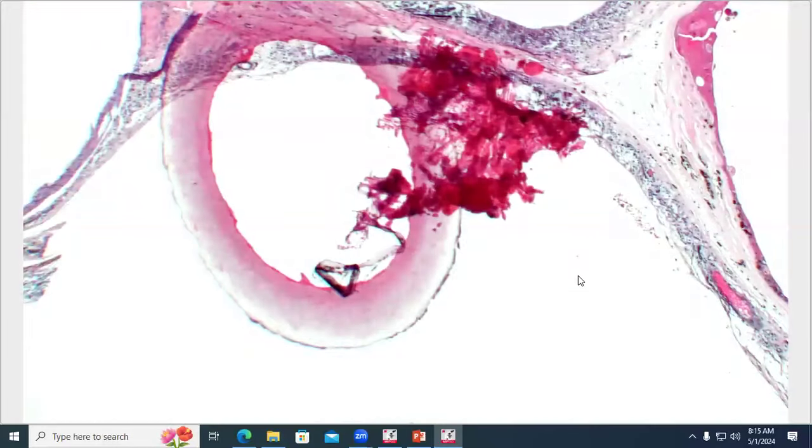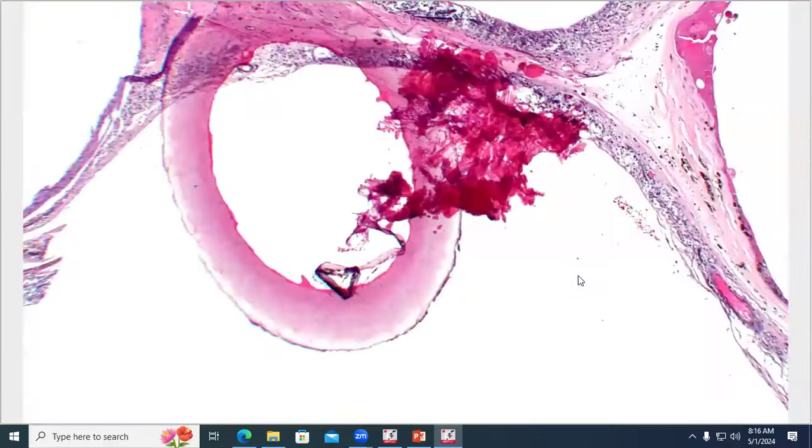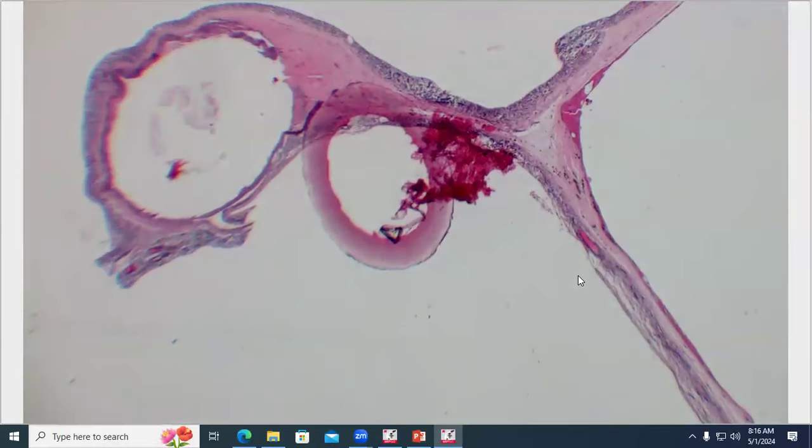So that's our foreign body. So it's a stiff, linear structure. Pull that out on top. Aha. Yes. Thank you for reminding me. It's a stiff linear structure that kind of is reminiscent of a hair. So perhaps a modified hair. And based on our past experience, this histologic and gross presentation is most likely a porcupine quill.